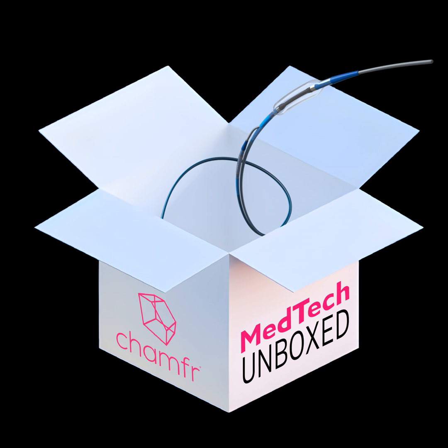You have some beta users right now, right? Some engineers that are testing this out. Are you getting feedback at a cadence, with different bugs or things that you might add or improve upon, based on feedback from the users? Yeah, the community has been incredibly helpful. I'm on my 4th or 5th public version release. People have been trying it out, giving me feedback on features and on bugs. It's been enormously helpful.